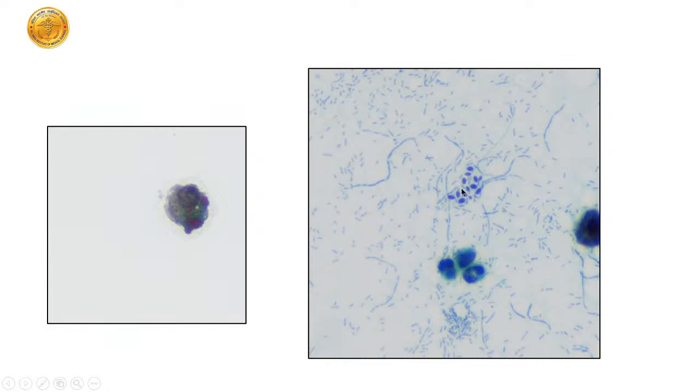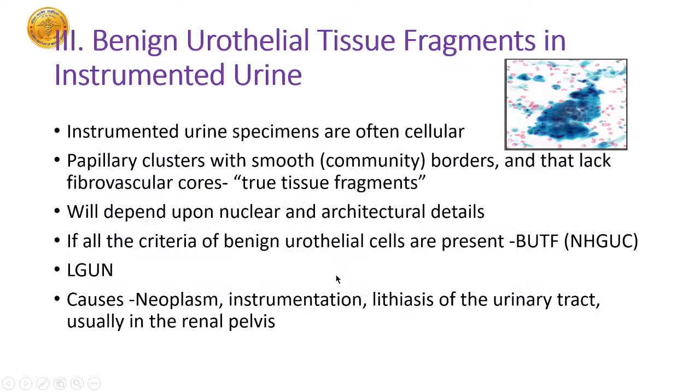Next slide, please. I've shown you two of the people who were responsible for naming these lesions. These are nothing but Melamed-Wolinska bodies in degenerated urothelial cells.